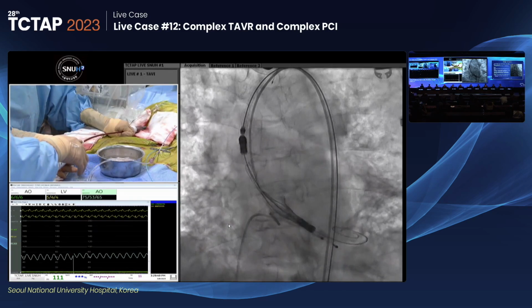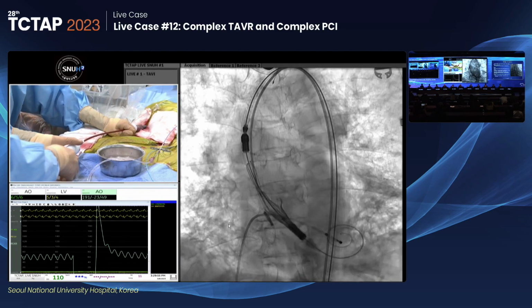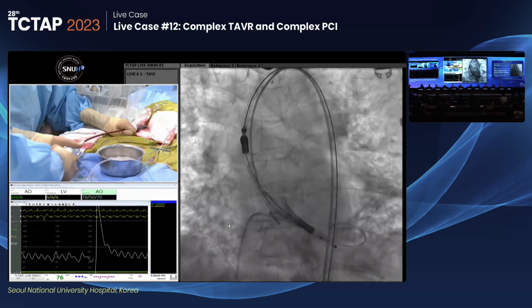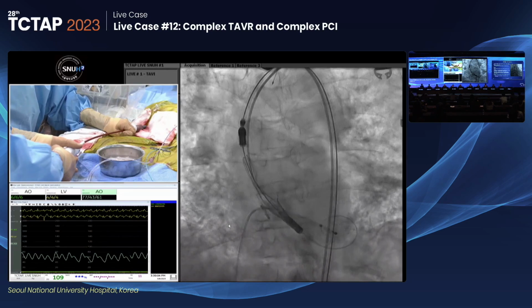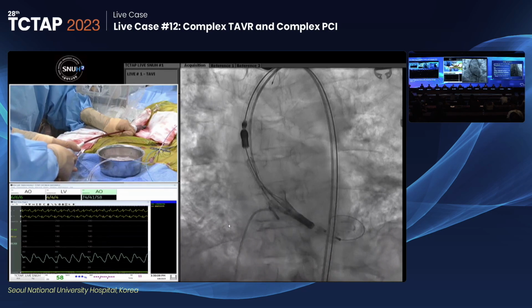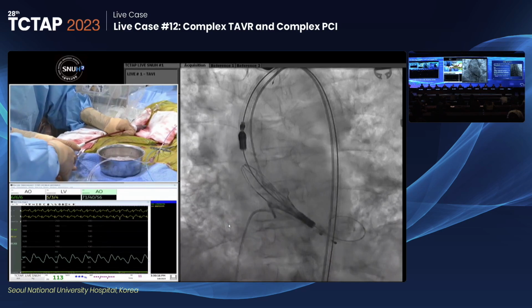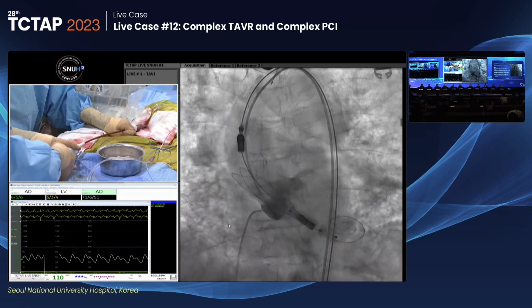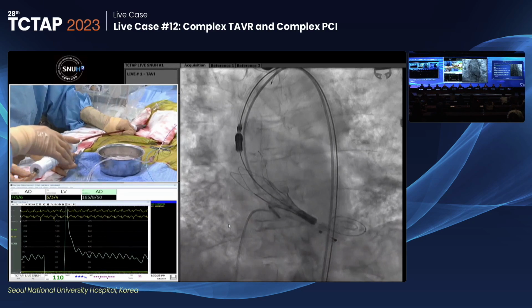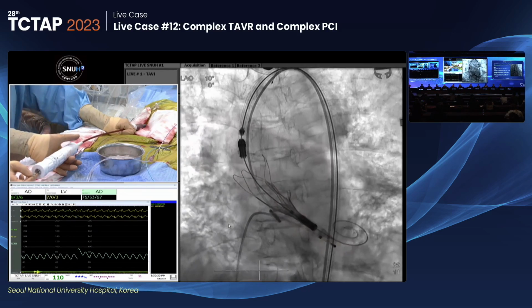The location is good. Very good. Here we see the expansion of the upper crown. Then we are going to slowly release the stabilization arch at the second step. Deploy, slow, slow. Okay, a little bit deep. Deploy. Okay. You can see the stabilization arch is deployed.